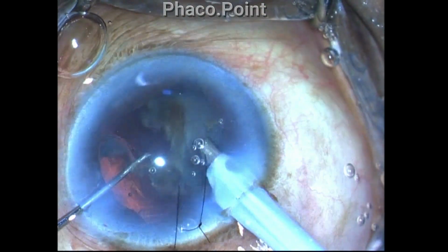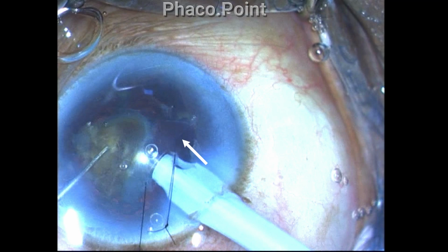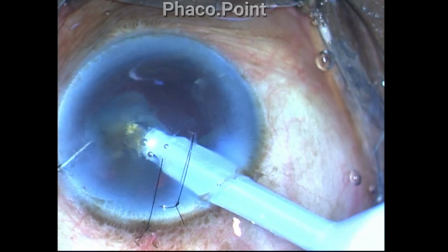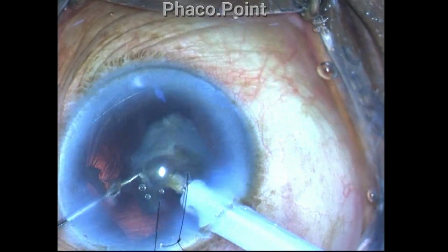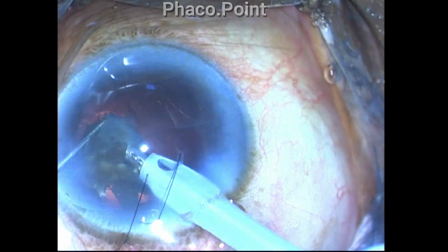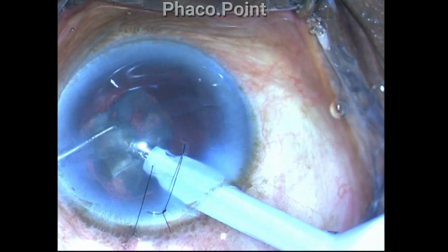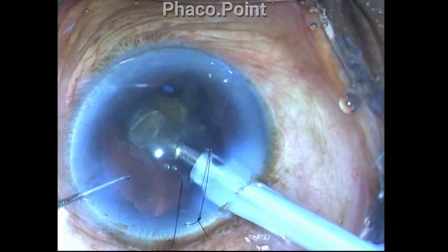So then I reach a point where there is just a single piece of nucleus fragment to remove. The Descemet membrane detachment makes its appearance once again, and I can see the flapping Descemet membrane. So at this point, I have just a small piece to emulsify. And I changed the phaco mode from the burst mode to the micropulse mode. And I decided I'll just finish off this phaco emulsification. Of course, I have to be very careful that I do not aspirate the fluttering Descemet's flap.